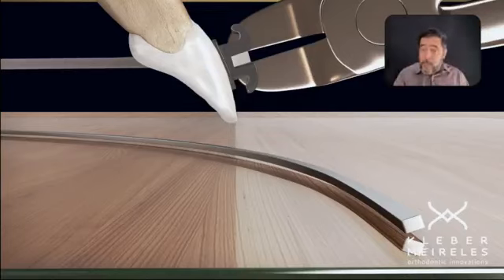And this is the same concept of applying a positive torque in the lower arch, a positive torque embedded in the bracket. I mean, if you have a positive torque for a class 3 case, for using elastics, for retracting, you are thinking the same way. You are trying to keep the inclination of those teeth. And this is not possible since we don't have enough space inside the symphysis.